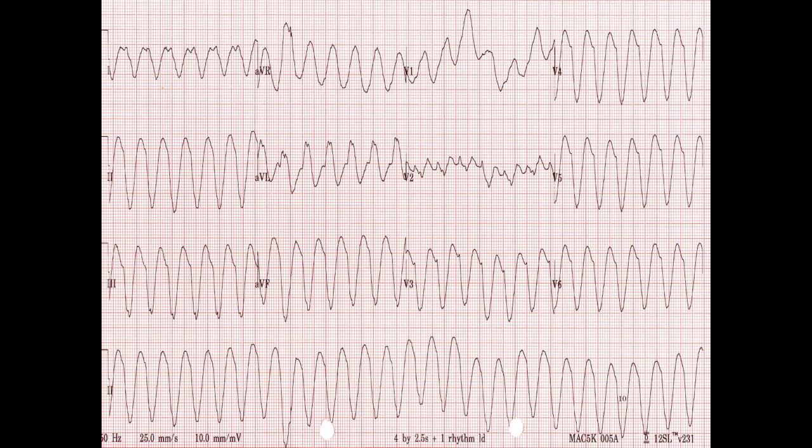And that's when we pull out all these criteria. This isn't for your unstable patient, because for an unstable patient with a tachycardia, wide complex tachycardia treatment is going to be somewhat similar. So just cardiovert them. So this is a stable patient. Just keep that in mind, please. But let's look at this one. Is it V-Tach or is it an SVT with aberrancy? It looks big, it looks wide, it looks nasty, it looks terrible, right?